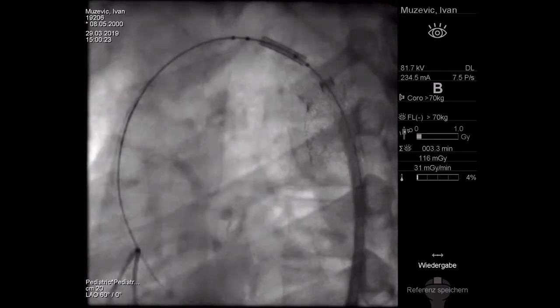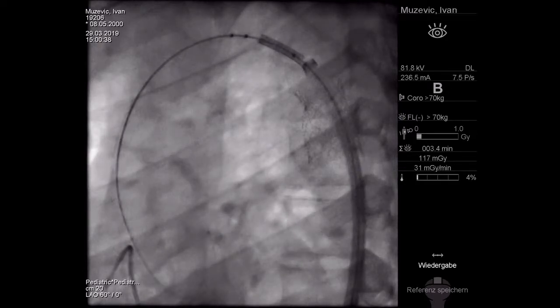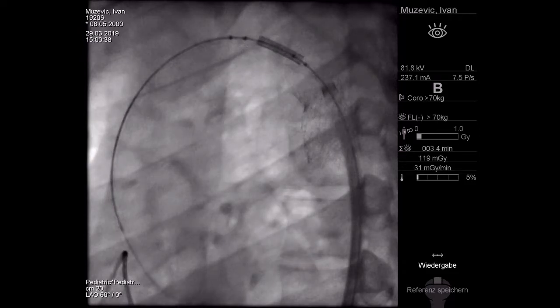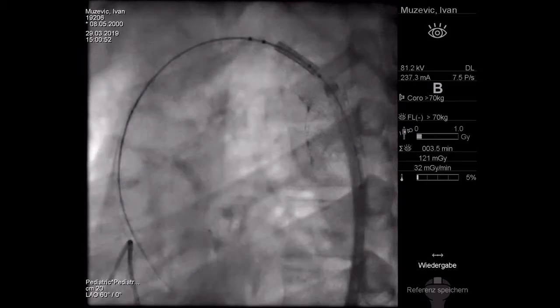Yeah, I think that's better. I think that's an interesting technique to use. Okay, I give it a little bit more. Wait a second. Something like that? I think many people would be comfortable with the asymmetric mounting. Okay, thank you. Yeah, I feel better. I feel more comfortable with this as well.